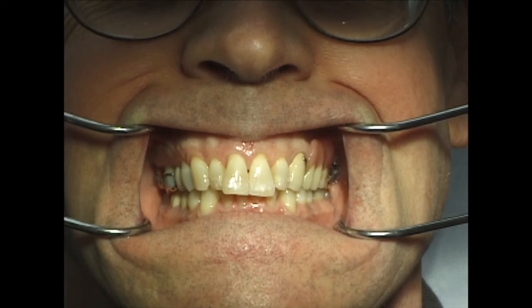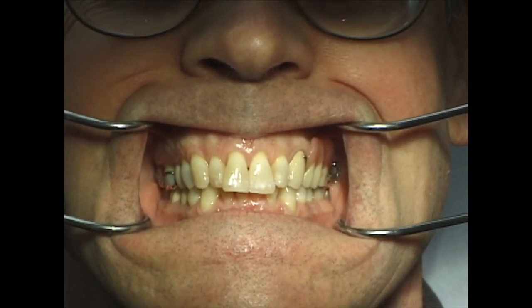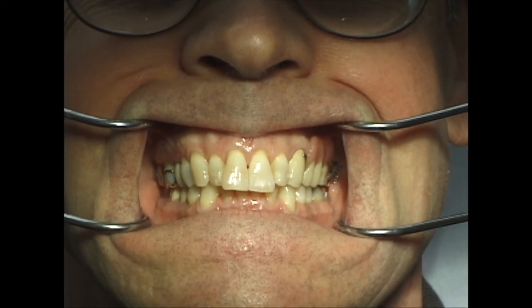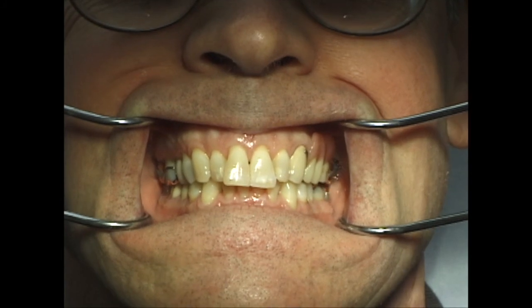Okay, now do your thing, Jay. I'll run it again. Watch very closely. And then go back to the other side again. Yeah, do it again.